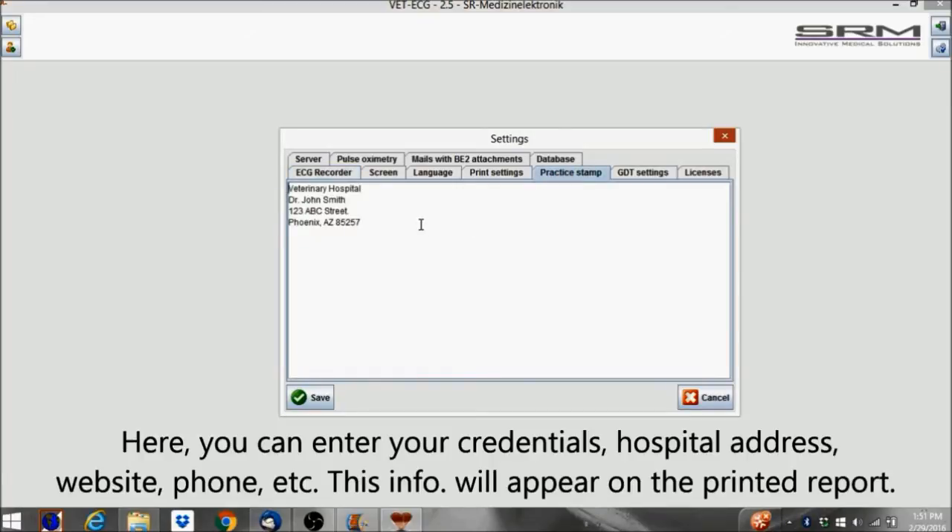Here you can enter your credentials, hospital address, website, phone, etc. This information will appear on the printed report.